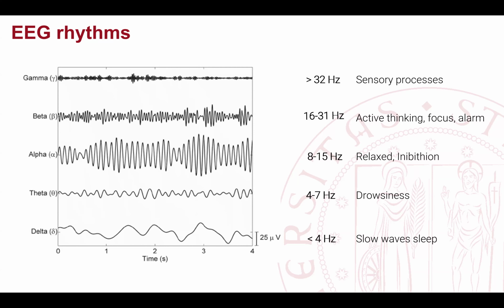Okay. So this is the only component of the EEG signal that you can really see visually, even without any specific processing. And it's also interesting, it sometimes happens, particularly with a subject that has this peak very high, that you ask them to close their eyes, and you see the increase of the alpha amplitude, and then you ask them to perform complex calculations, like complex multiplications, or whatever.